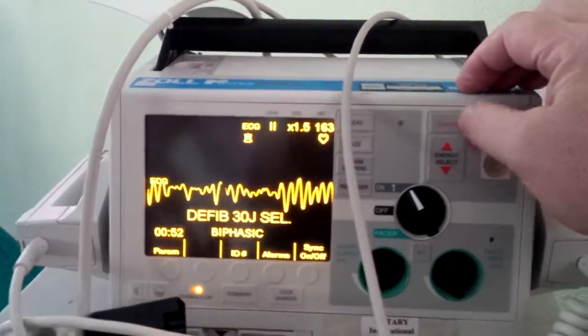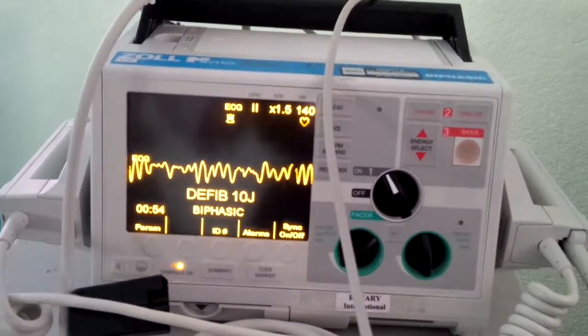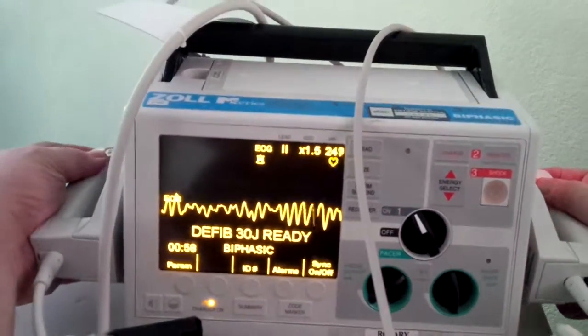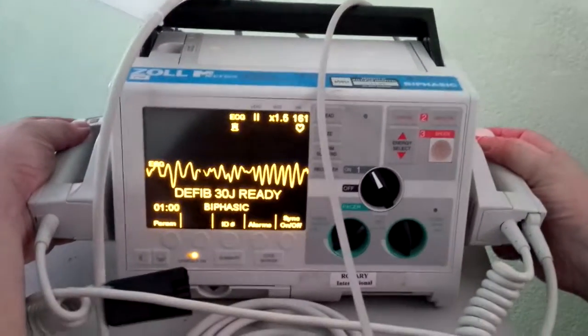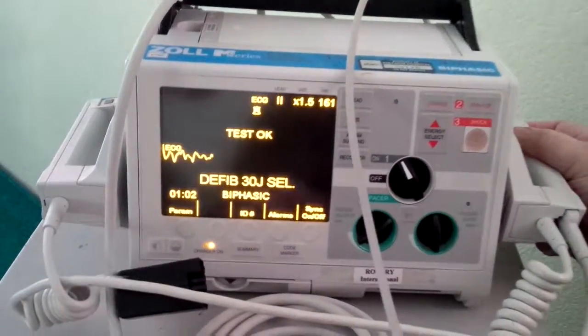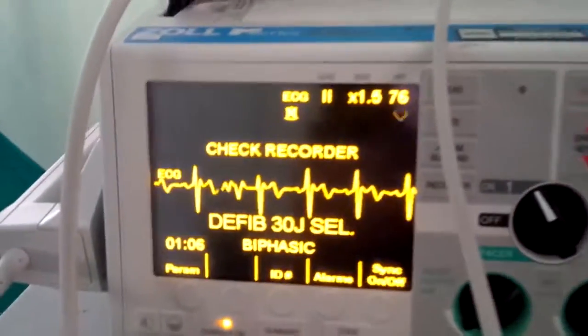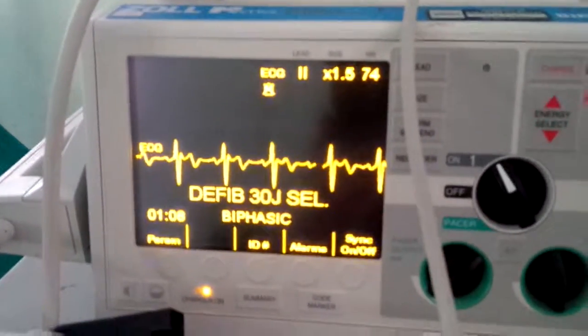We've got it charged — note the audio. When it gets to 30, we have audio. I'm clear. You're clear. We're all clear. Then we check pulse and we check rhythm. Voila — sinus rhythm.